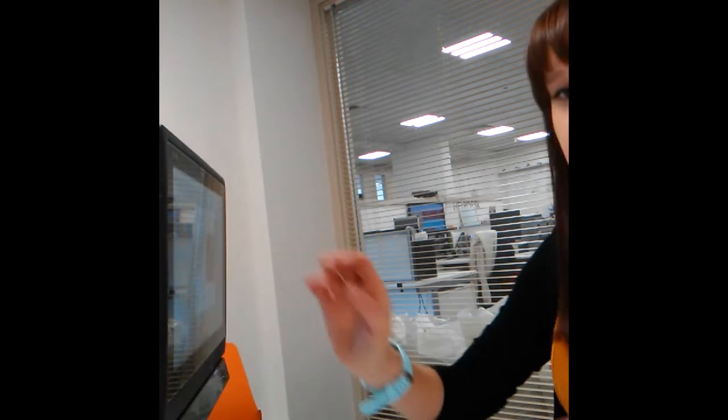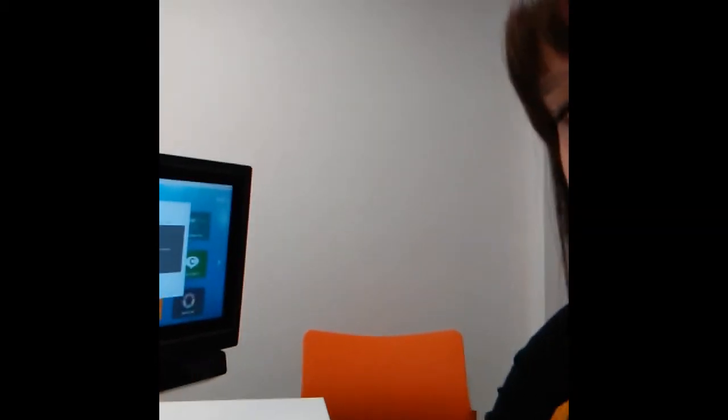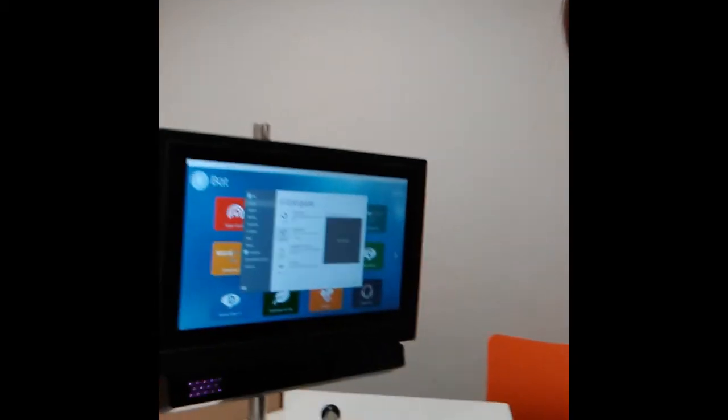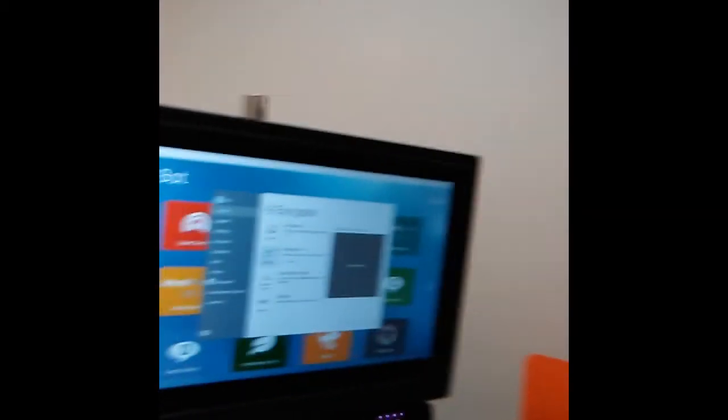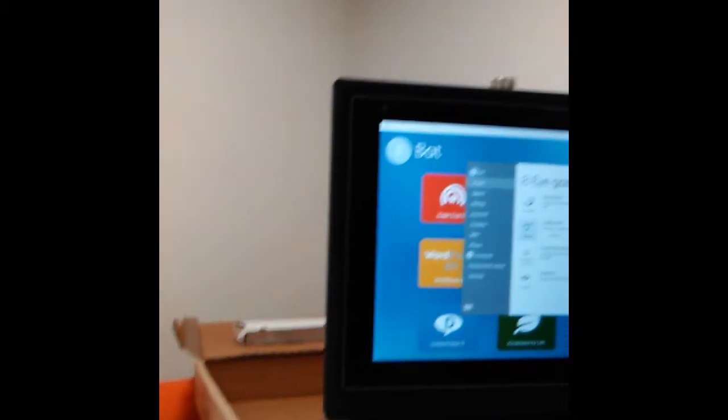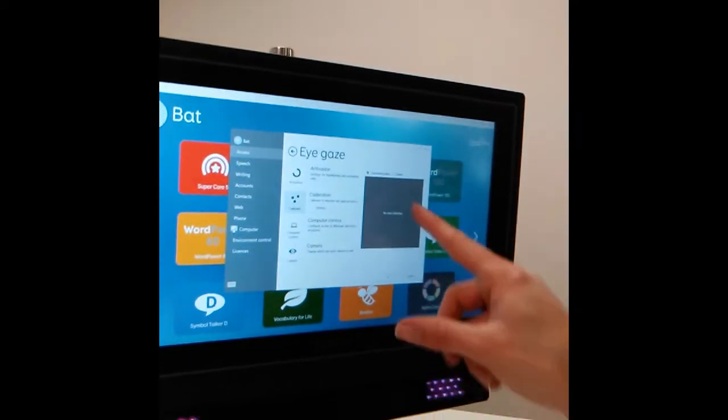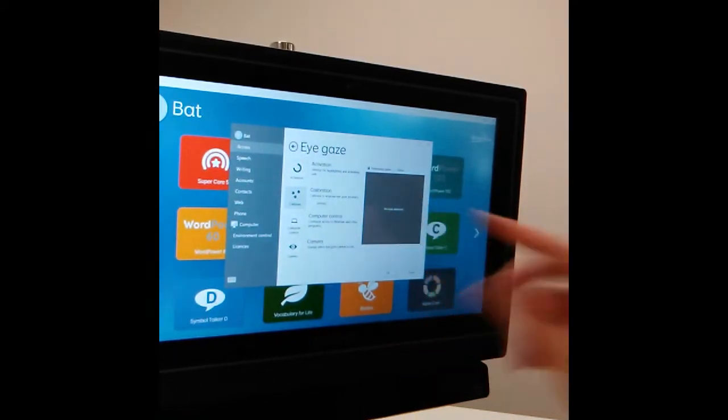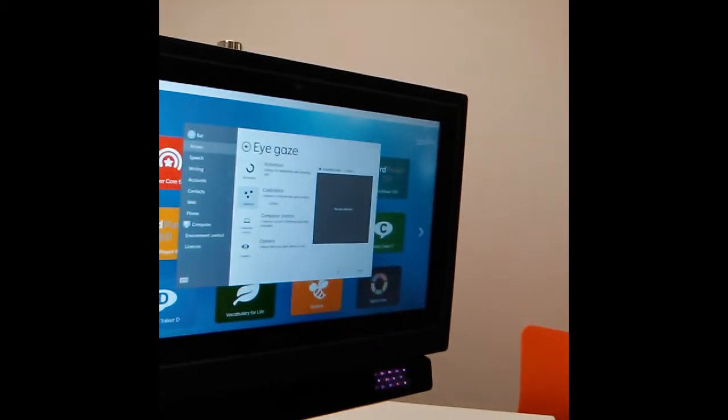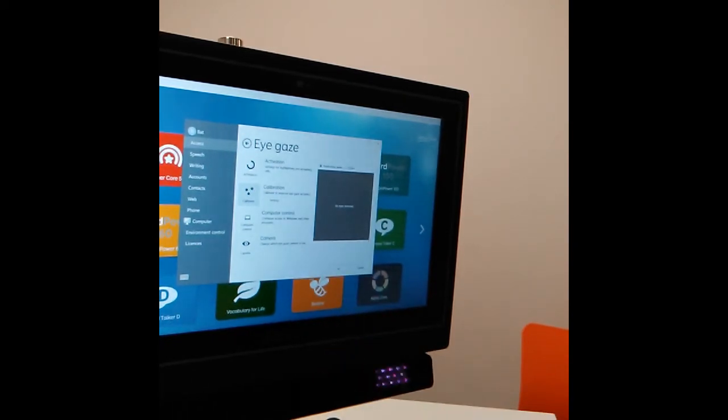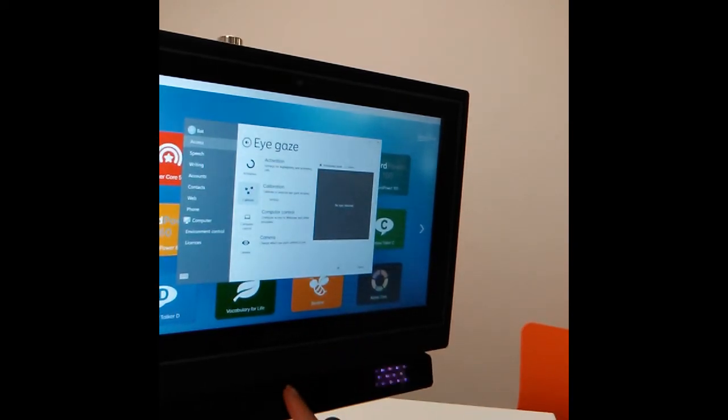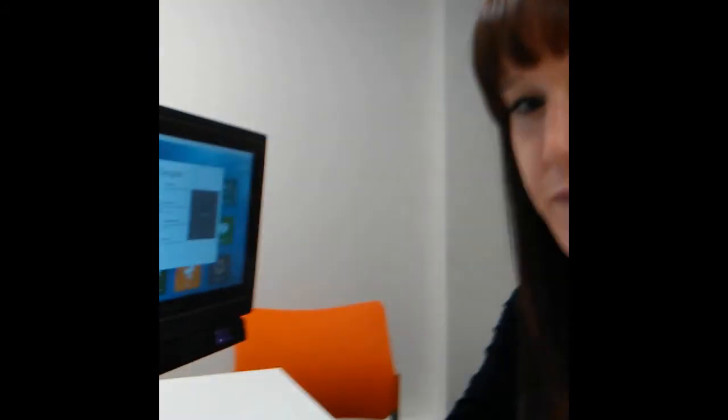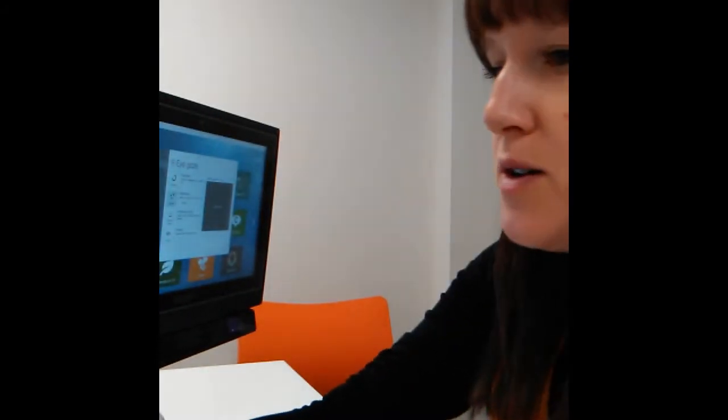Okay, so currently this is not picking up my eyes. In this square it's saying no eyes detected. What we need to do is reposition the device to enable this camera to be able to see my eyes looking at it. I'm just going to try and do that now.